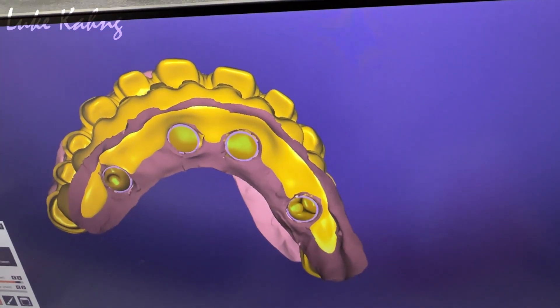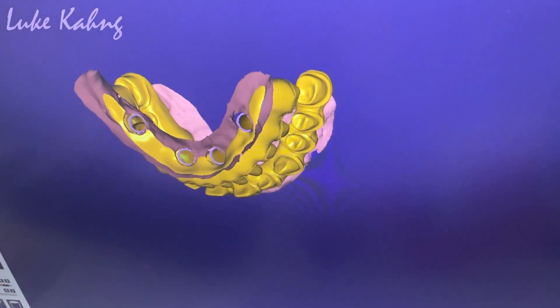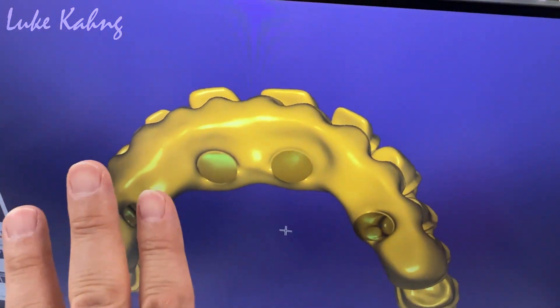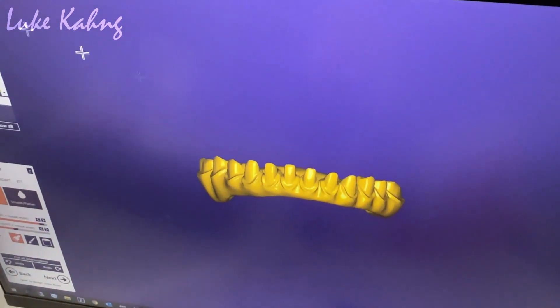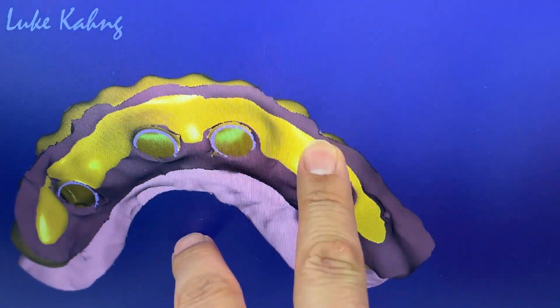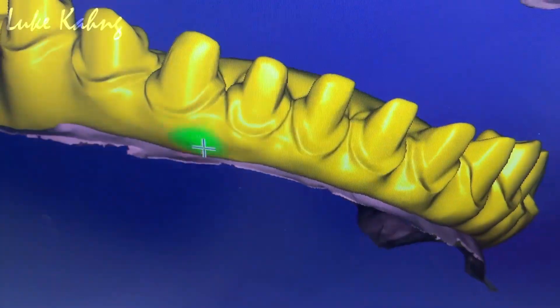Lower — same thing. Let me see, especially lower — take it out of the tissue. It's bigger, change it. Especially the facial — yep, so you can grind a little bit. Let me see underneath. Okay, cut it a little bit more, bring it in here — there. Then it will be okay.